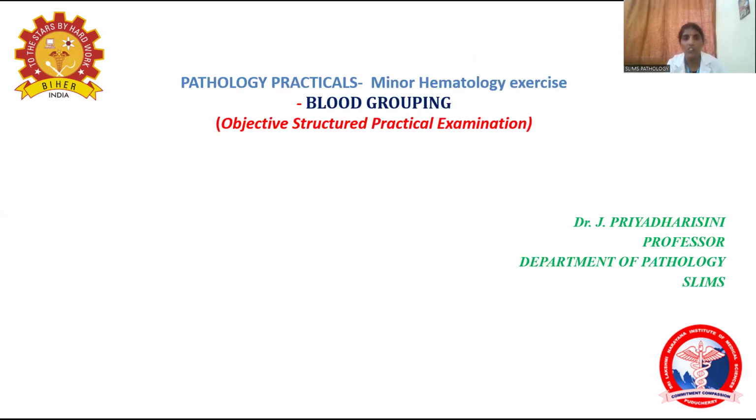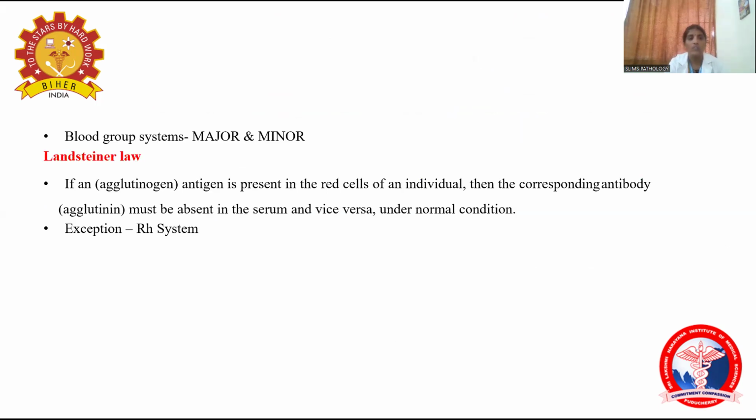As I've already told, this is part of the pathology practical exam, which comes under minor hematology exercise. And I will be discussing a little bit in detail about the theoretical part of blood grouping and also regarding OSPE, which is objective structured practical exam. So this is a continuation or revision of what you have learned in your first year, right?